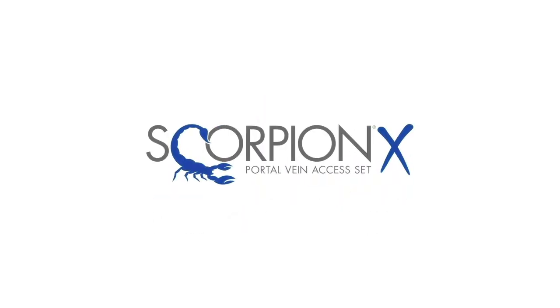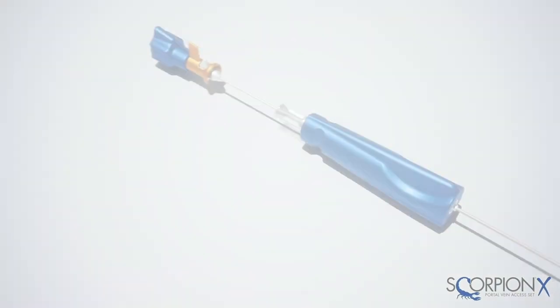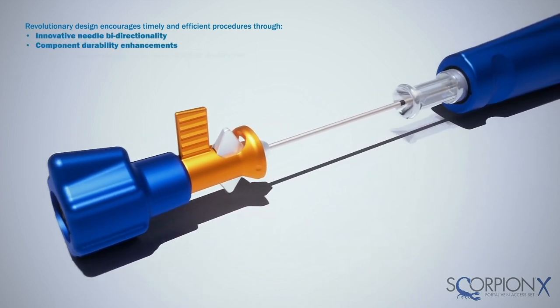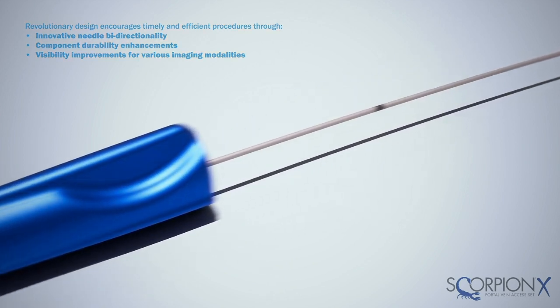The ScorpionX portal vein access set, revolutionizing how you perform TIPS and other portal vein procedures. Argon ScorpionX portal vein access set uses first-in-market capabilities designed to simplify procedures by providing bi-directional control in conjunction with enhanced visibility and durability.